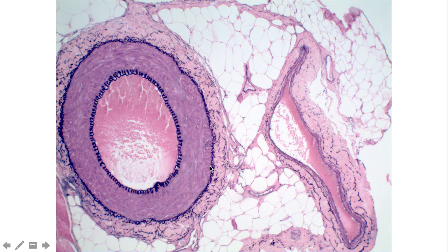Then we're going to have our tunica media, the smooth muscle layer that makes up the majority of this muscular artery, followed by this next dark purple line. This is the external elastic lamina. And then outside that is going to be the tunica externa.